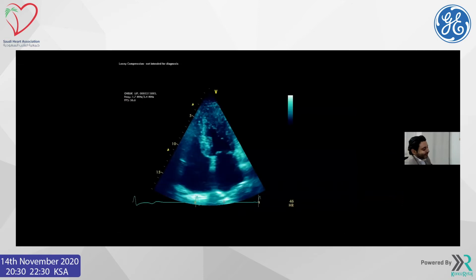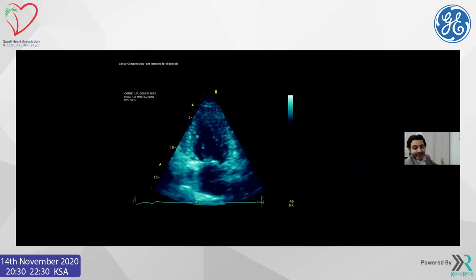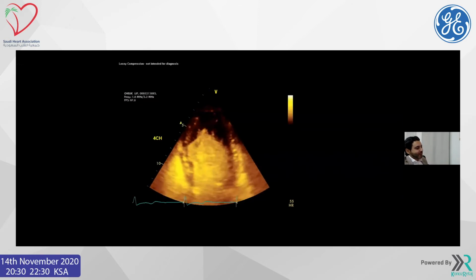Another from the panelists, anybody help me and tell me what is the diagnosis? Typical hypertrophy. Good, good. Are you confident? Good. So 100%. Is it 100% now? Exactly. So this is the typical presentation of apical hypertrophy.